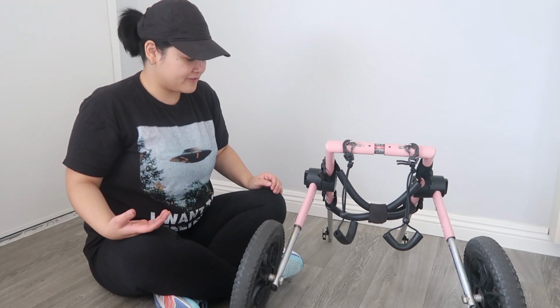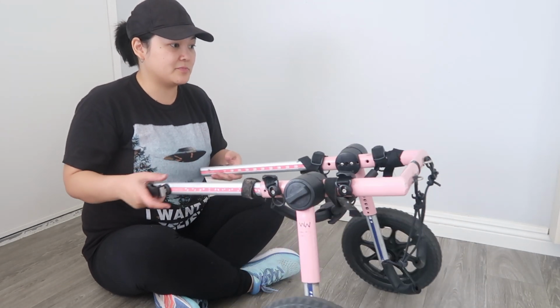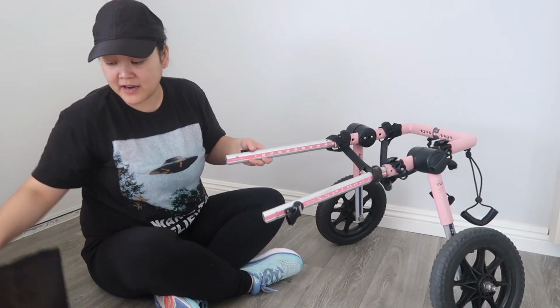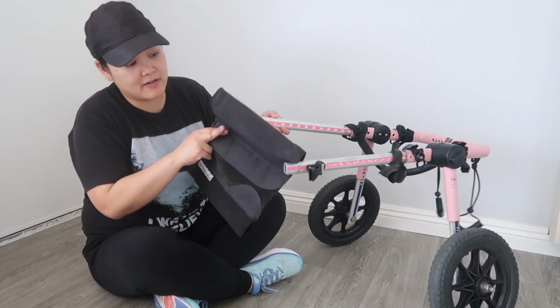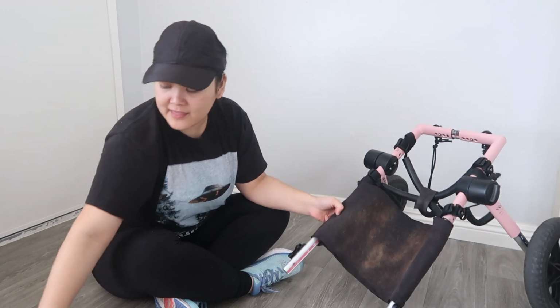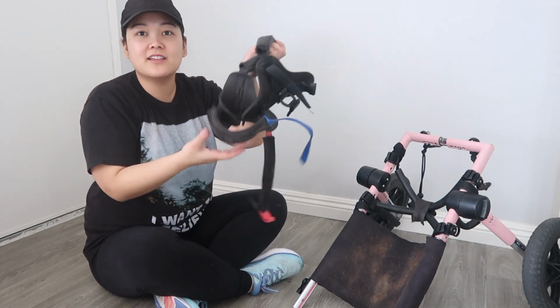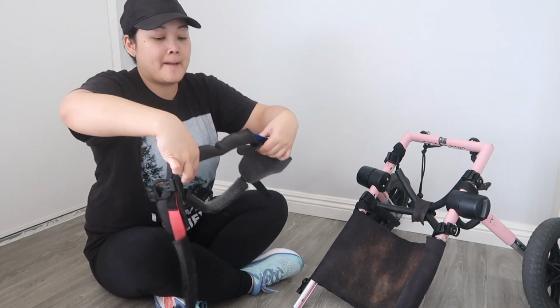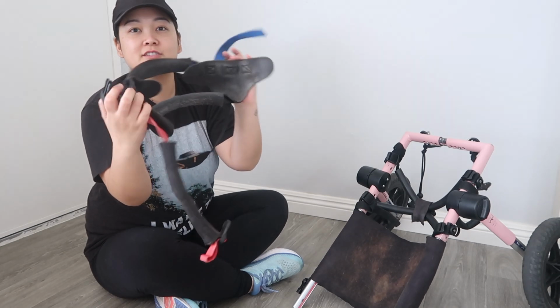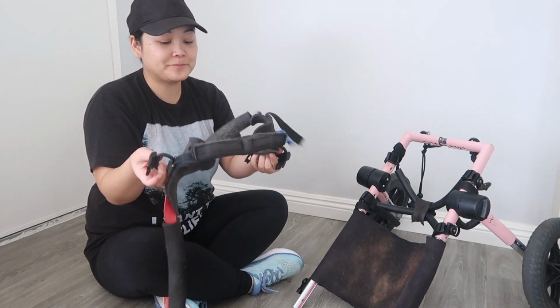And I think that was it for the walkthrough of the wheelchair. I don't know if that was super thorough or helpful. Hopefully it was. But I'll show you guys how I put Zoey in now. And then you might see these little buckles here in the front, and that is to connect the harness that goes on your dog. Sorry, everything is just so hairy because of Zoey. But this is what the harness looks like, and then there's the other end to the buckles here. So you attach it, so then she's secure.